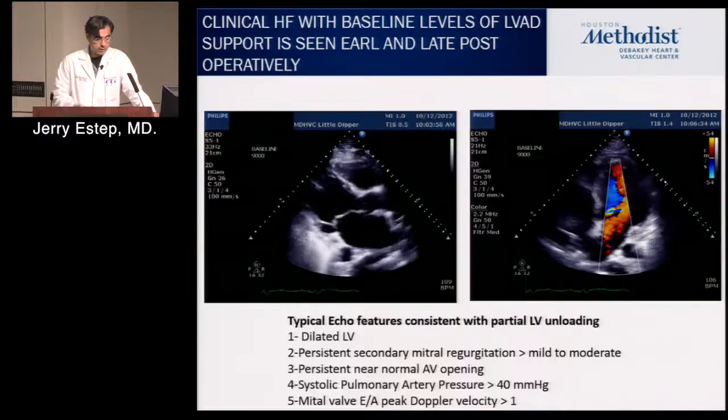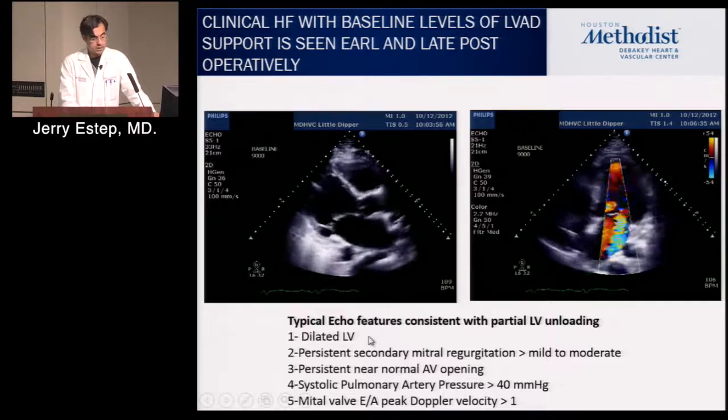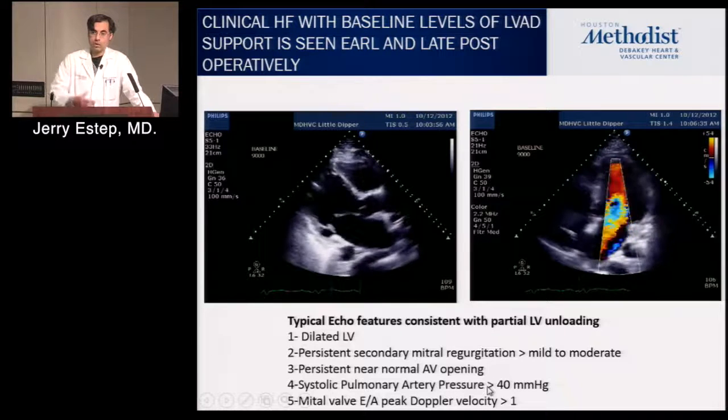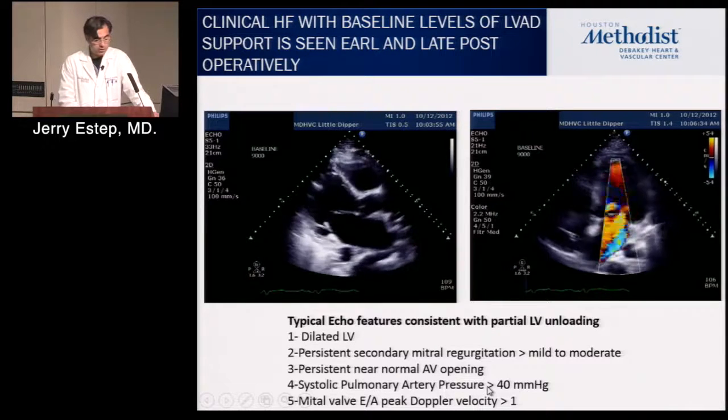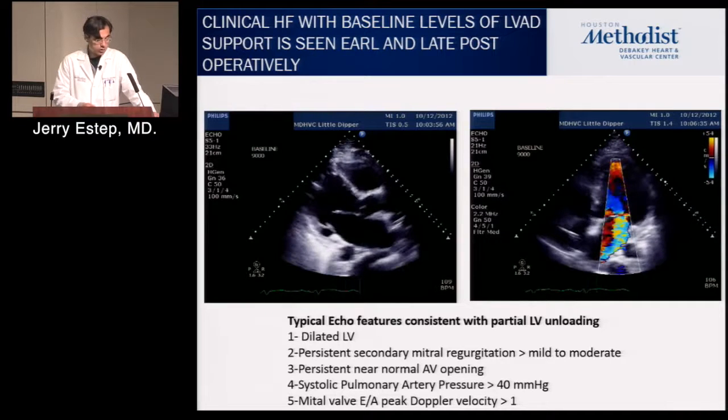And I mentioned that typically goes away with most. So the features that we're looking at are the LV size, MR severity, aortic valve opening status, and then the conventional spectral Doppler indices that can give us a good hint on LV filling pressures.